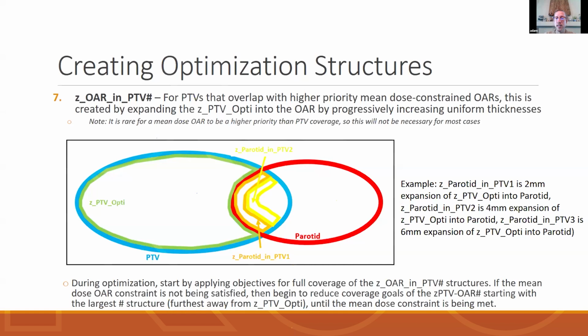Again, just wanted to stress about all of these equations so far, all it comes down to are those few first simple rules that Brendan talked about. Small organ at risk, 10% per millimeter; a bigger organ at risk, closer to 5% per millimeter. Between PTVs, symmetric falloff, anywhere from 3 to 5% per millimeter. Those few basic rules are all that you really need to think about, and then the rest is just simple math.